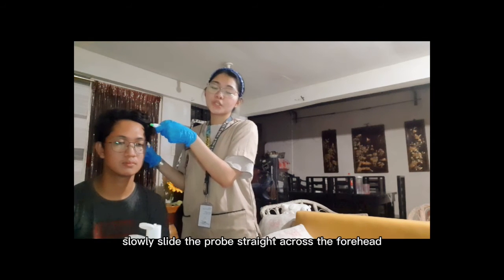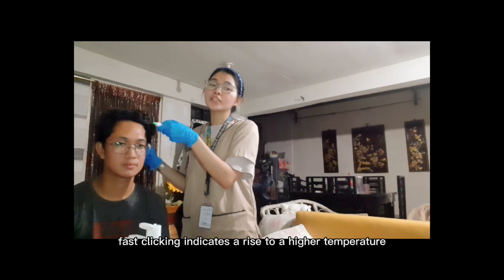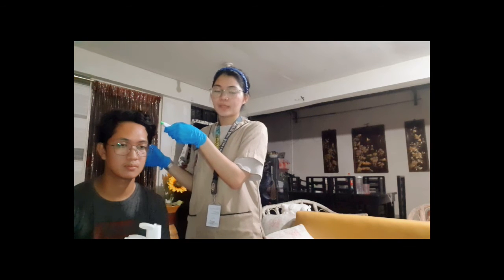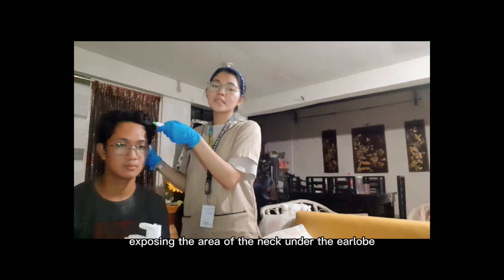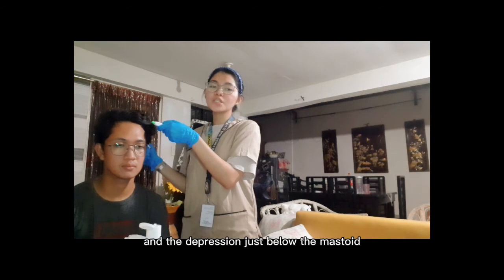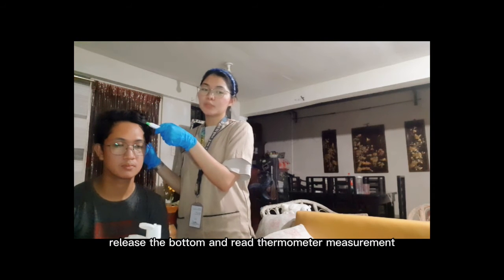Slowly slide the probe straight across the forehead and midline to the hairline. So the thermometer will click. Fast clicking indicates a rise to a higher temperature, and slow clicking indicates that the instrument is still scanning, but not finding any higher temperature. Then brush hair aside if it is covering the ear, exposing the area of the neck under the earlobe. Then lift the probe from the forehead and touch on the neck just behind the earlobe, and the depression just below the mastoid. Then after that, release the button and read the thermometer measurement.